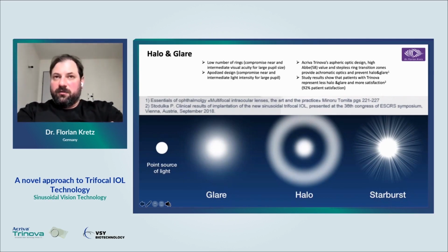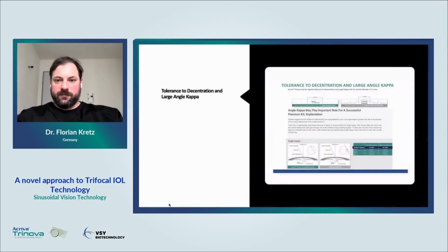It's just they need to know what they have to look for. And most of my patients come back and say, oh, doctor, I do see those rings now. They're a little bit disturbing, especially in the beginning, but they're happy because they know the optical system works for them.